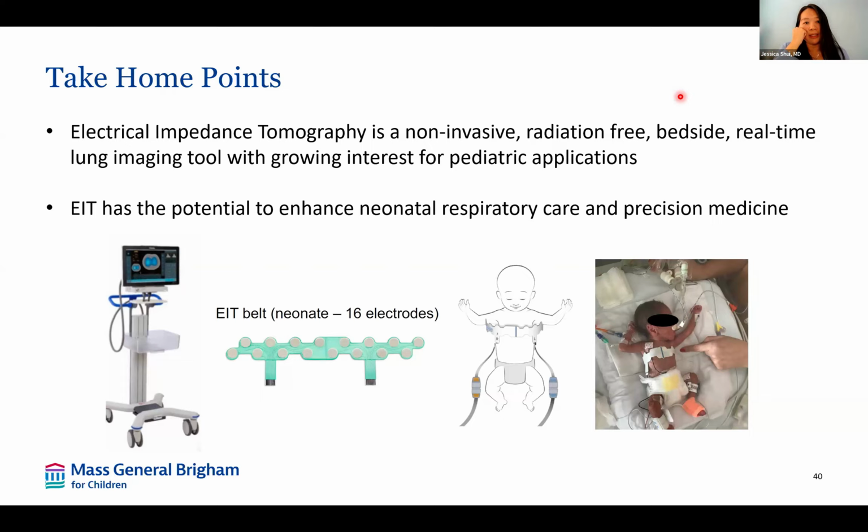And we were able to still make assessments with that adaptation. And then somebody asked about the tool being only FDA approved for neonates greater than 30 days. So how are you getting parental consent, is this all for research purposes for those that are under 30 days?